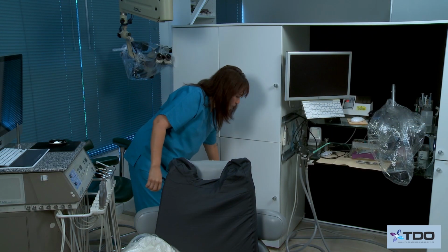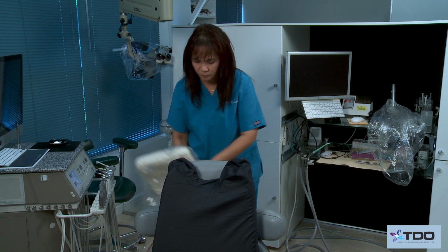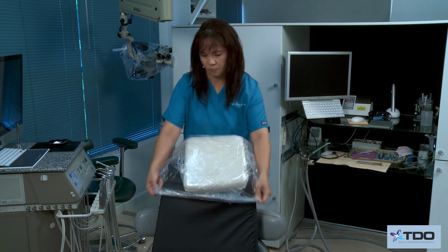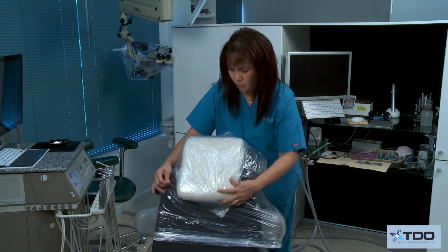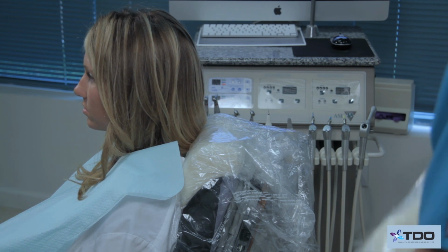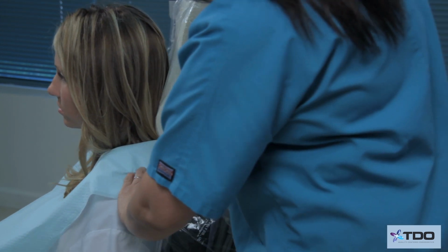The lack of headrest is compensated for by the use of a Tempur-Pedic pillow, which is placed behind the patient's shoulders. This pillow supports the head and neck and is very comfortable for the patient. As shown here, sometimes a second pillow is needed for support.